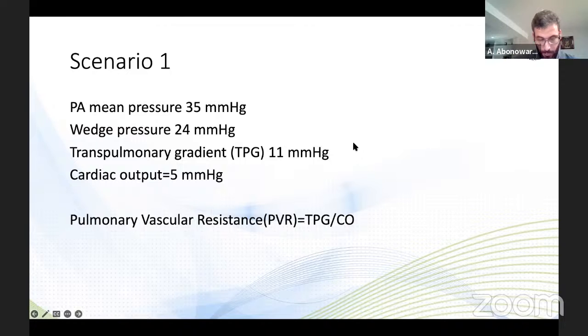And just quickly, Dr. Sam Haley, can you comment, for our young colleagues, on how to prepare patients and on potential complications? We have to go to the basics and make sure that's done right and the patient gets off the table safely and all the measurements are done correctly. Sometimes you have patients with severe aortic stenosis with low-flow AS, where the measurement will be inaccurate.